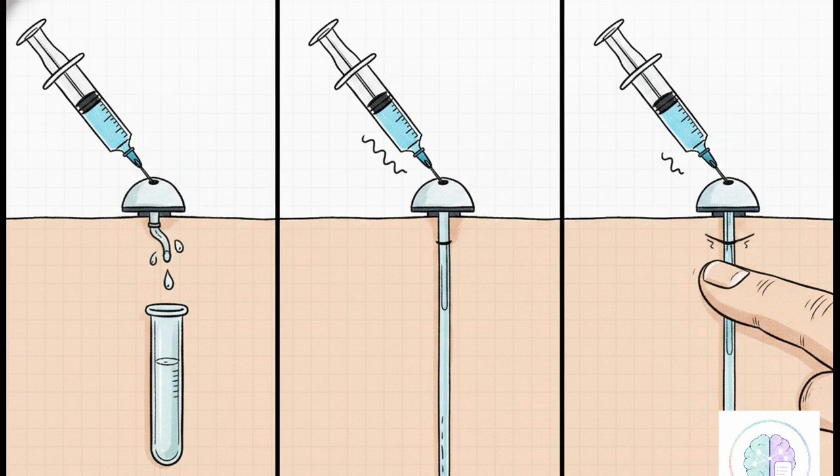Let's look closely at the protocol for the radionuclide injection. Once you've successfully tapped the reservoir, you first drain 2 to 3 milliliters of CSF, always making sure to send 1 milliliter off for culture and sensitivity. Then you inject the radioisotope, again, usually 1 millicurie of technetium, though 0.5 to 3 is the usable range, mixed in 1 cc of fluid.